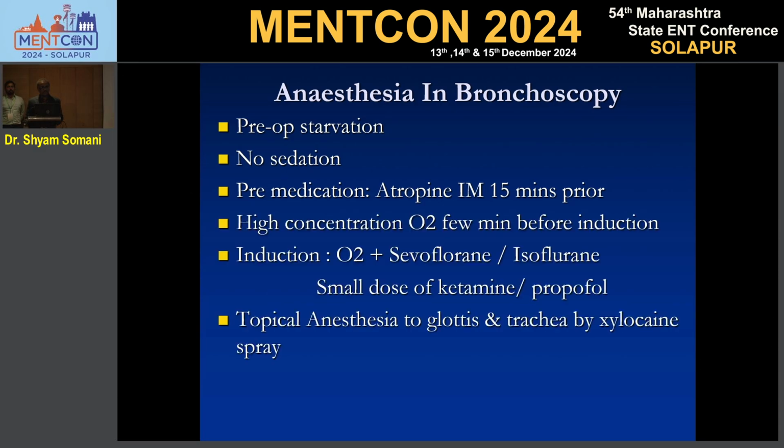Now, routinely, sedation is avoided and pre-op oxygenation is desirable. If possible, bronchodilator in the form of nebulization, if the child allows, should be done. Induction is usually preferred nowadays with sevoflurane because it is very good, and in 3 or 4 inspirations or breaths, the child goes into sedation, and then you can put the IV line.